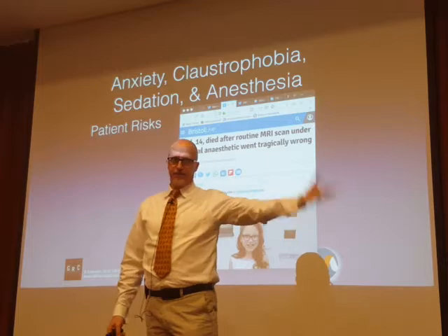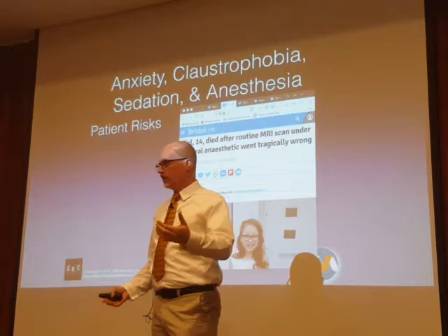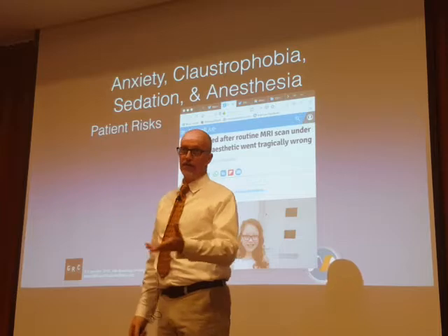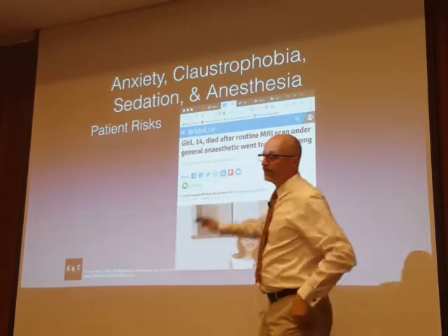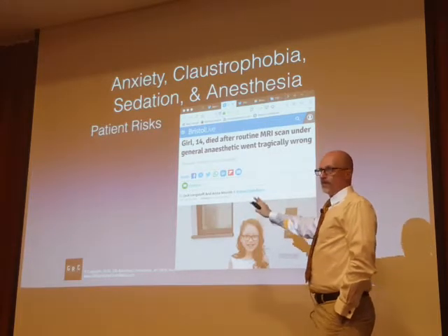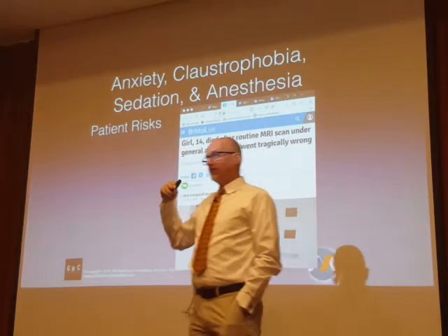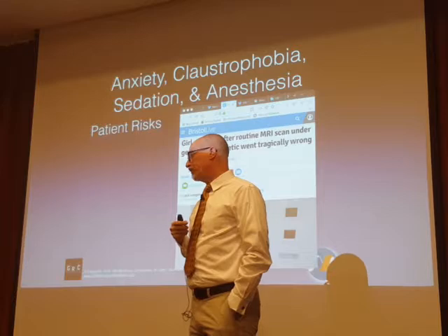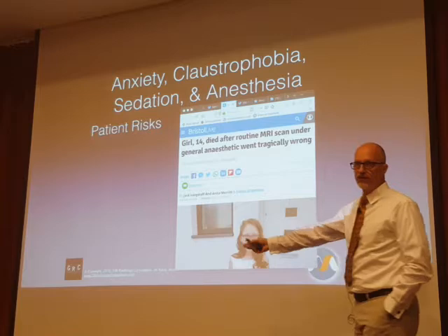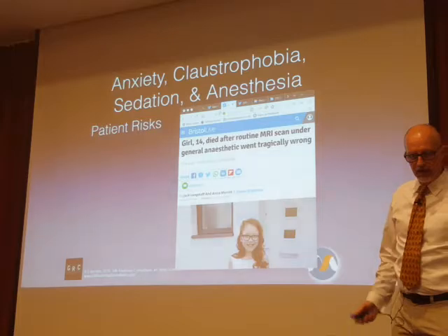And anesthesia may not know what MR is trying to do, and MR may not know what anesthesia is trying to do, and nobody may know where we should take this patient to try and get them the clinical support that they need. So if at your facility you provide heavy sedation or general anesthesia care, please make sure that these processes for critical patient care are defined in advance. It's not enough just to have the MR conditional device. Having a coordinated plan is also essential.